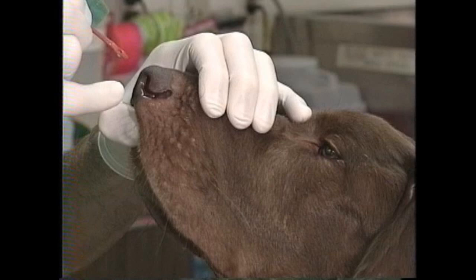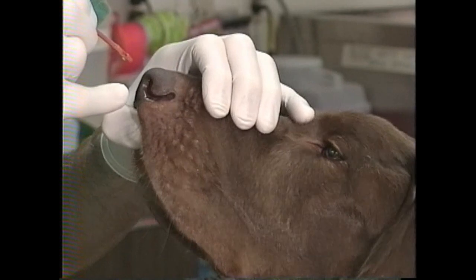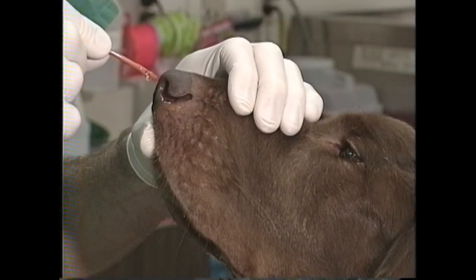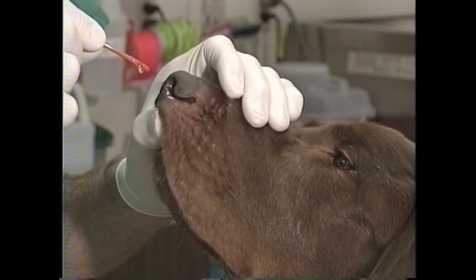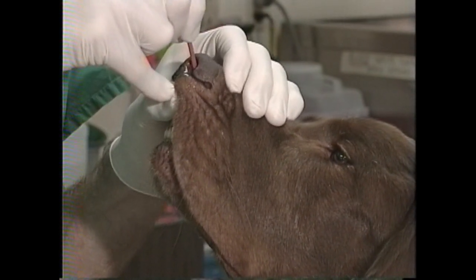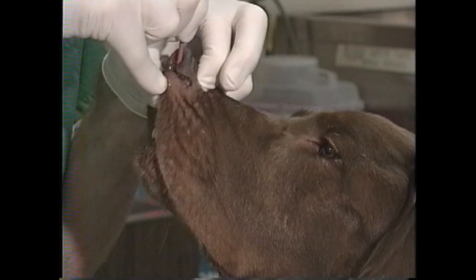Once the catheter is inserted into the nostril by about a centimeter, I can start with the mushing and pushing of the nose. In this video I actually don't advance the catheter into the nose until I've already pushed the nose up, but in practice I typically will put it in first and then lift the nose up.